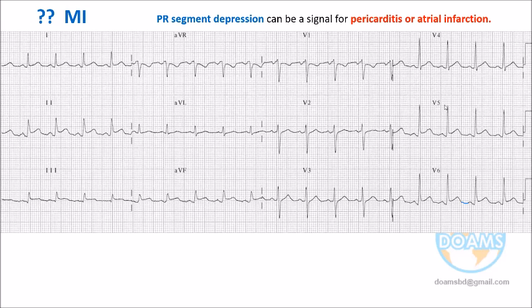Yes, sir. Dr. Sabine said there is inferior myocardial infarction. I have given the query mark here. Is the ST elevation coved up like a cap? No, the elevation is not coved up. Can anybody identify anywhere the ST elevation is coved up? Anybody? No. Actually, no. So we are now confused whether this is myocardial infarction or not.